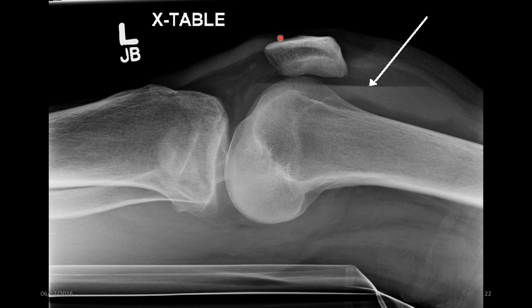Cross table means horizontal beam. So this person is laid on the trolley most likely. And that allows you to see that fluid level quite nicely.